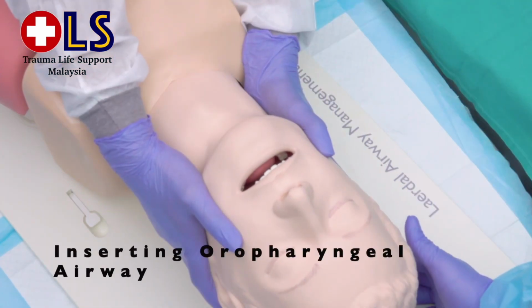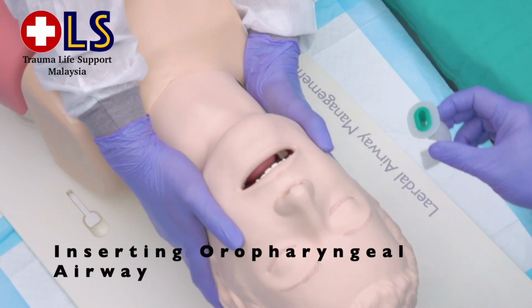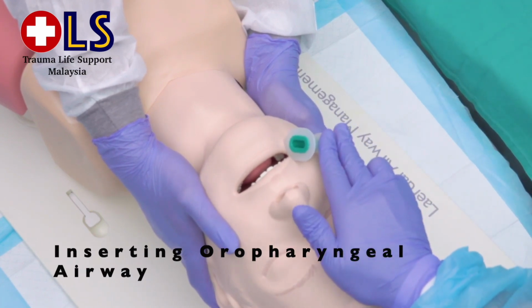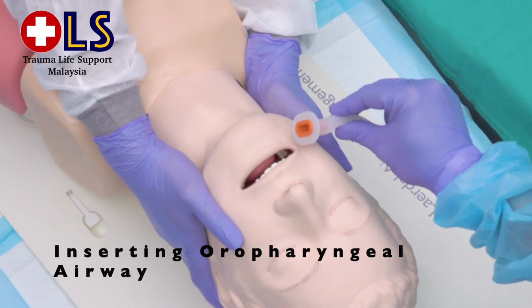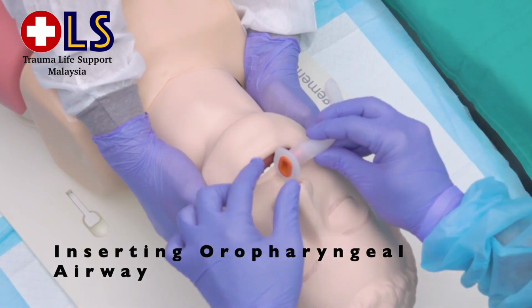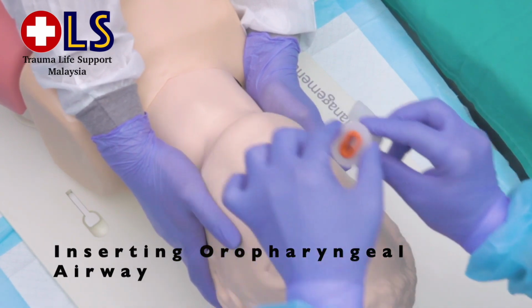Next, we will need to insert an oropharyngeal airway. First, we need to measure. There are two ways of measuring. One is from the corner of the mouth to the tragus. This is not the correct size. So again, get the appropriate size from the angle of the mouth to the tragus, or from your incisor until the angle of the mandible.